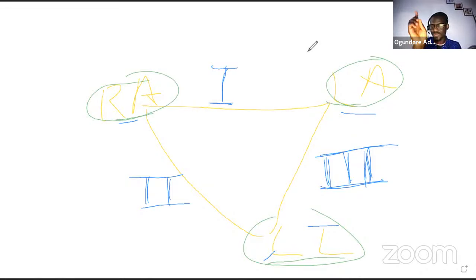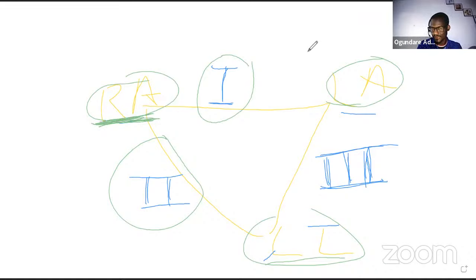If you have artifacts, like interference that is peculiar to, for example, lead 1 and lead 2, then you can understand that you need to adjust your right arm electrode, because it is the right arm electrode that generates lead 1 and lead 2.